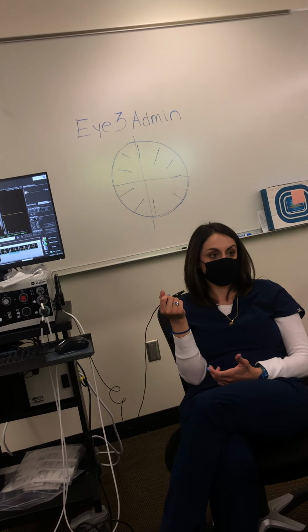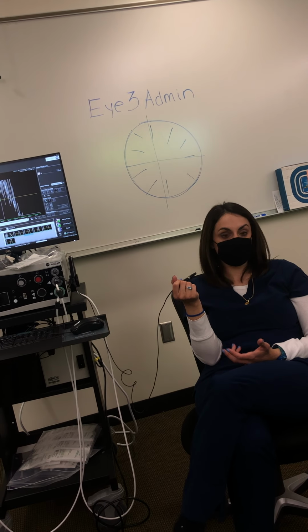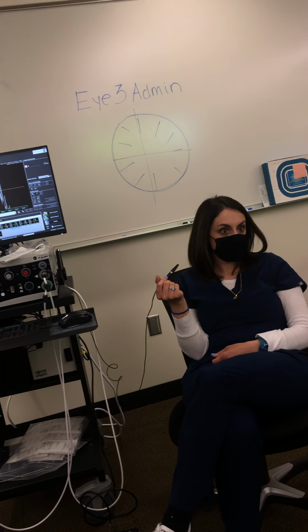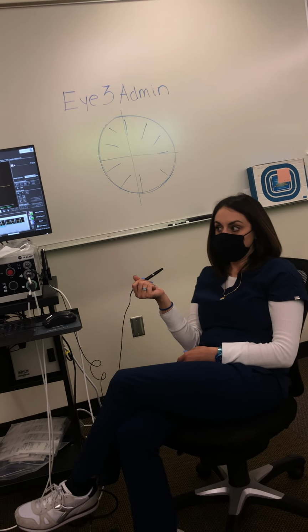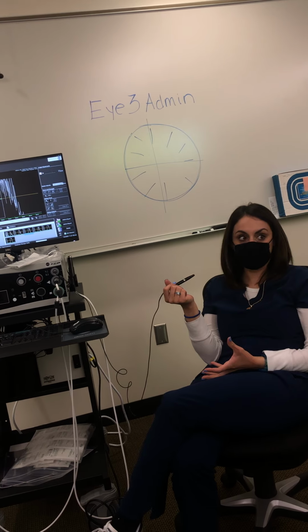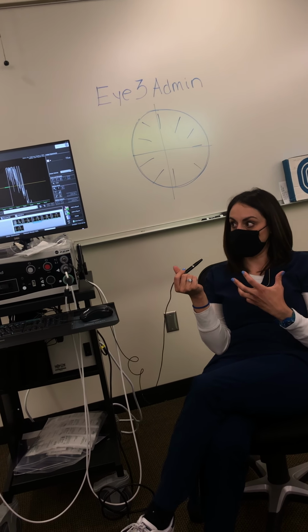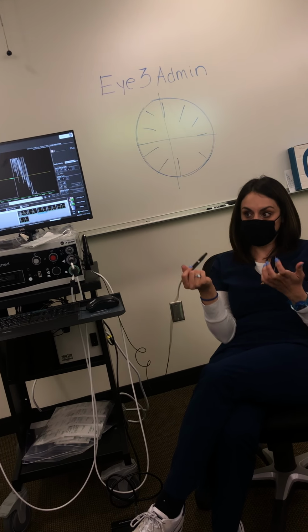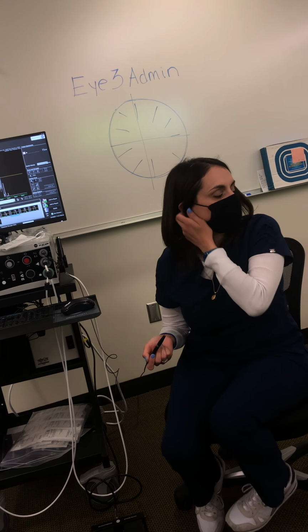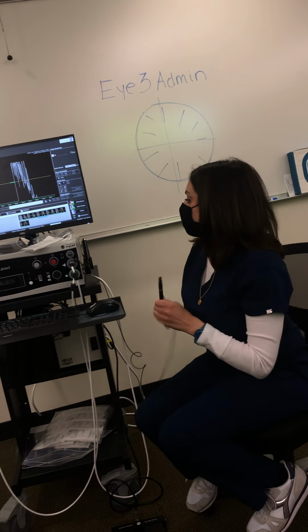Some patients can't adjust where they're looking. You can say, look straight ahead, and they'll be looking over here. To them, that's straight ahead. That's where social cues are really, really important with patients. You can't get mad at them and say, you're not looking straight ahead, because to them, they are looking straight ahead. And that's why it's not cookie cutter.